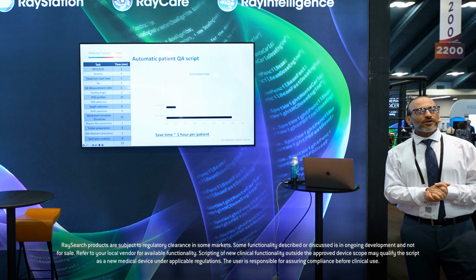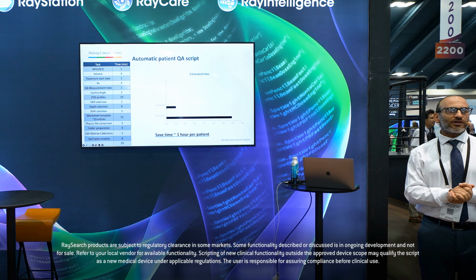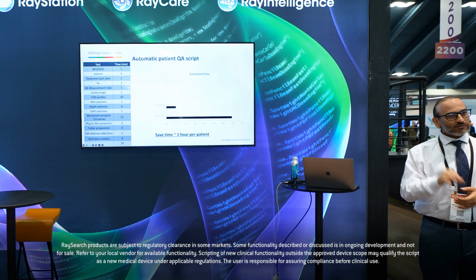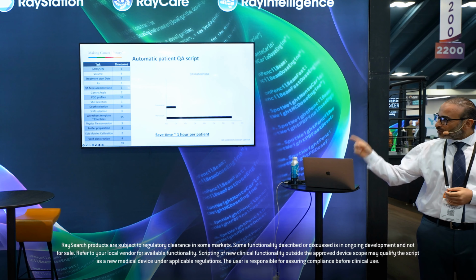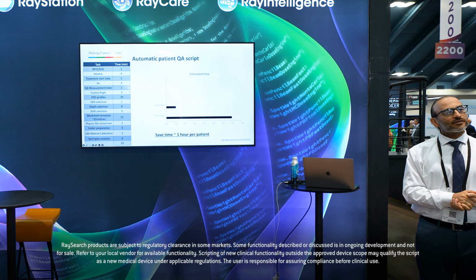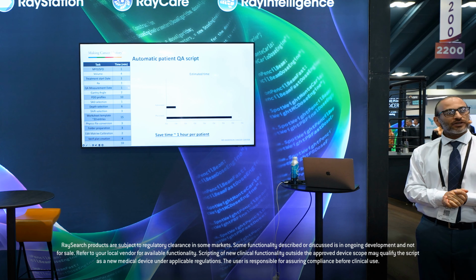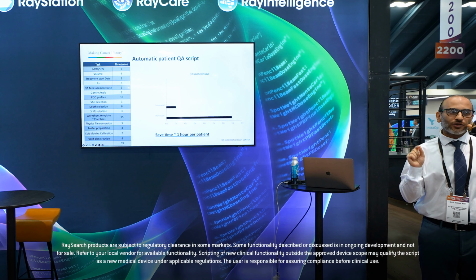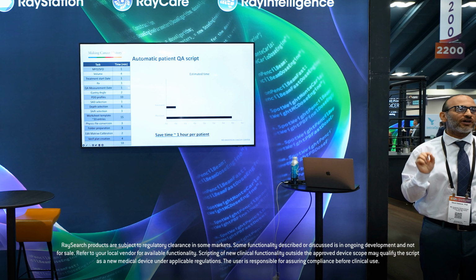I remember maybe 2 or 3 weeks ago, we had 30 patients. So doing this calculation, if you have 30 patients with around 50 to 70 minutes per patient, to finalize 30 patients' QA during the weekend, we need 40 hours.